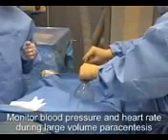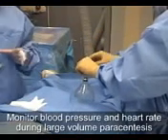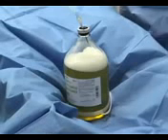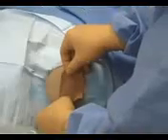Blood pressure and heart rate should be monitored during large volume paracentesis. Once the desired quantity of fluid has been removed, withdraw the catheter and apply a bandage.